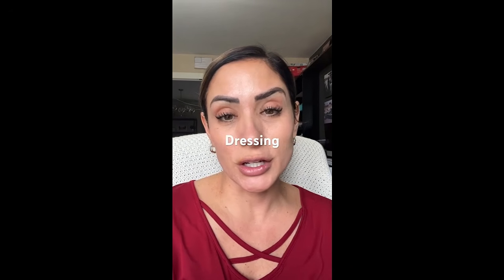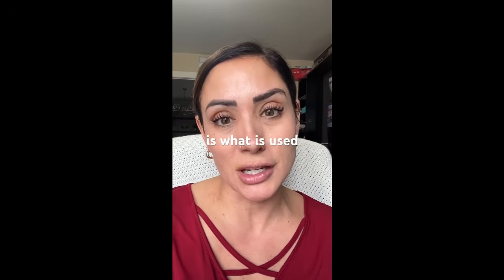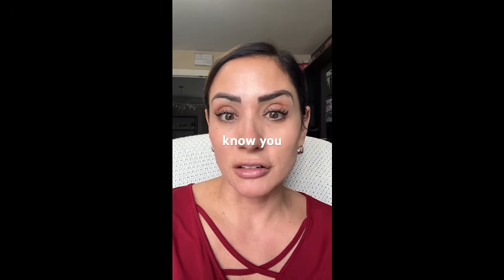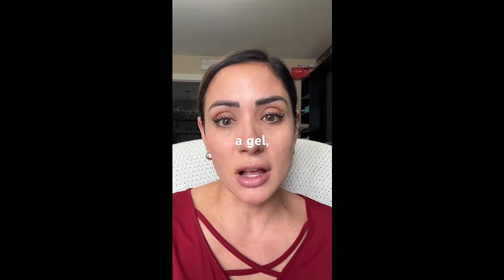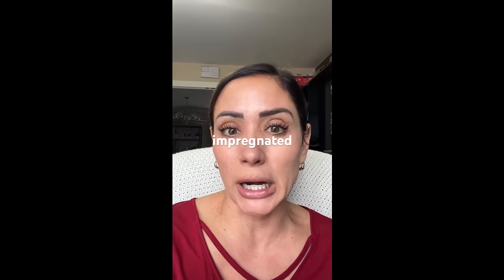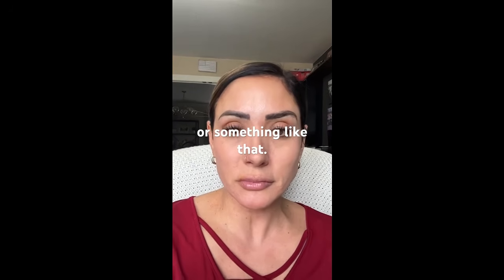This week on Wound Dressing Categories with Lizzie, we're going to discuss honey dressings. So medical grade Manuka honey is what is used in honey dressings that are on the market. Just note, you can't use any honey. It's the medical grade Manuka that you should be using. These dressings can actually come in a variety of forms. So it can be a gel, it could be a sheet, it could be a composite dressing, meaning it's impregnated into, let's say, an alginate or something like that.